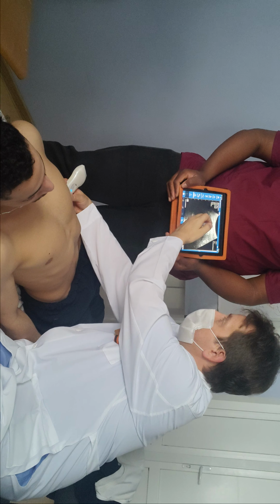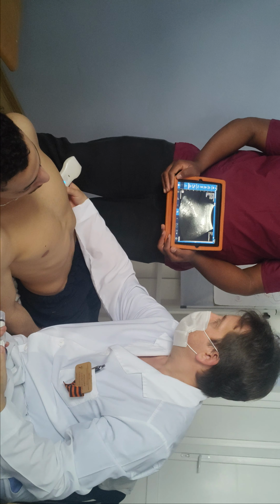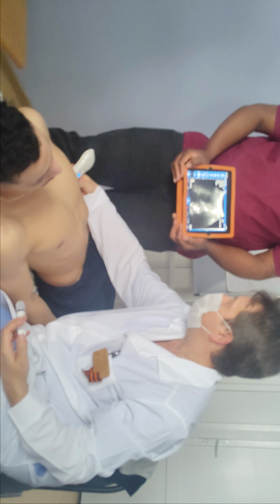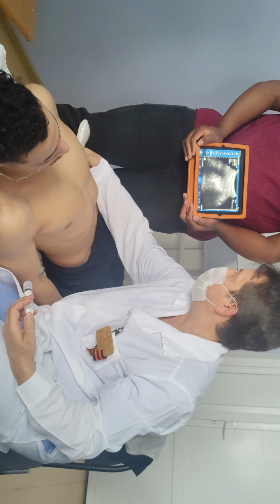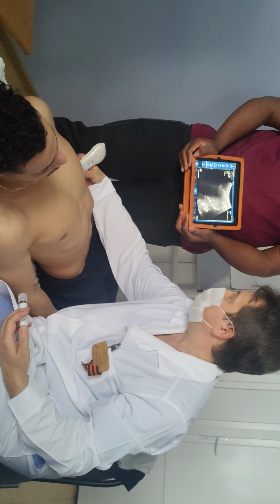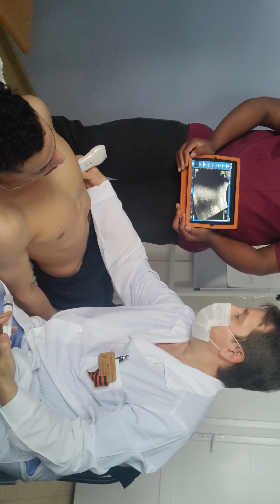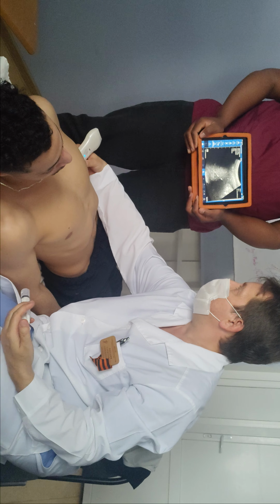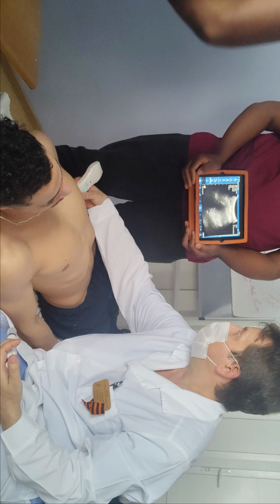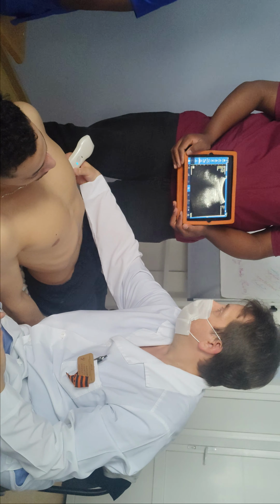This part of kidney and the upper part of the spleen are also glued together. In some cases you cannot see the full rounded shape of that organ, but you must try to find at least part of it, like here for example. This is spleen, this is part of kidney. Again, they are glued together. Now we try to find the symptom of pneumothorax. Breathe again, please.